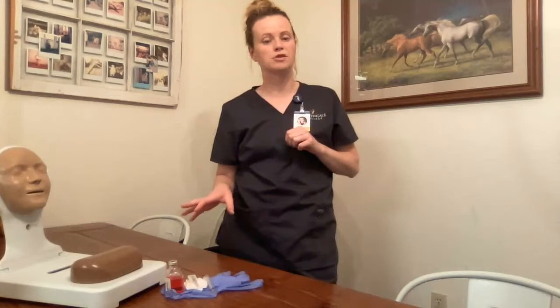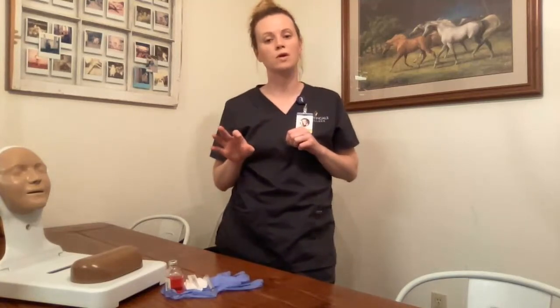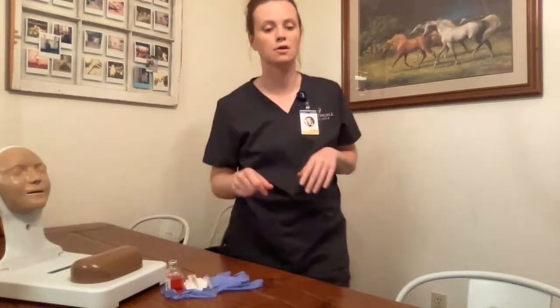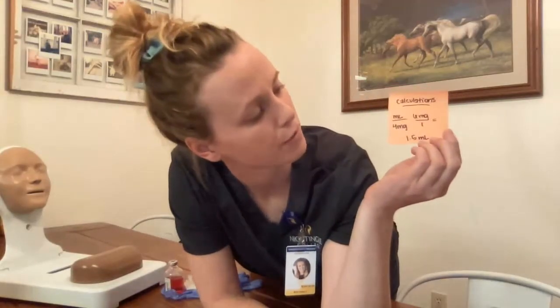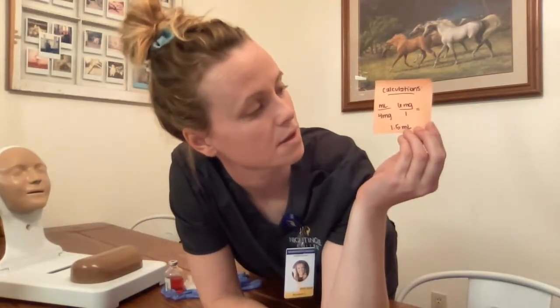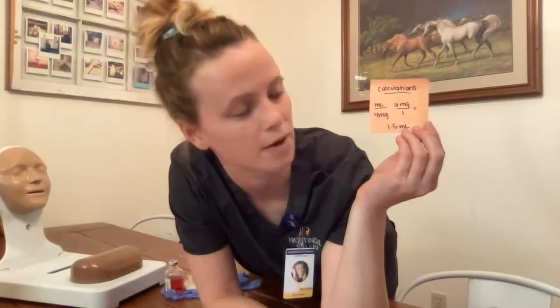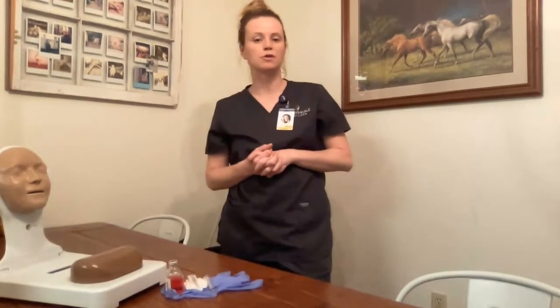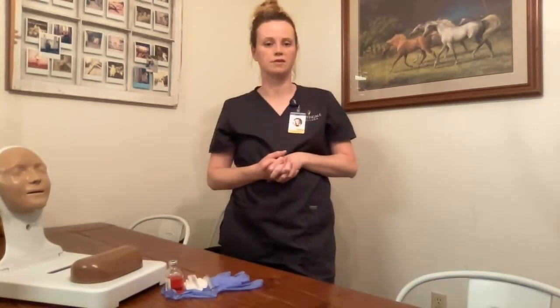The medication ordered for my patient is morphine sulfate injection, and the order reads one dose of six milligrams, IM, meaning intramuscular. I do a dosage calculation regardless of how simple the calculations are. On a post-it note: 1 milliliter over 4 milligrams — which is what I have on hand — multiplied by the order, which is 6 milligrams over 1, equaling 1.5 milliliters. So I will be giving my patient 1.5 milliliters of morphine sulfate.